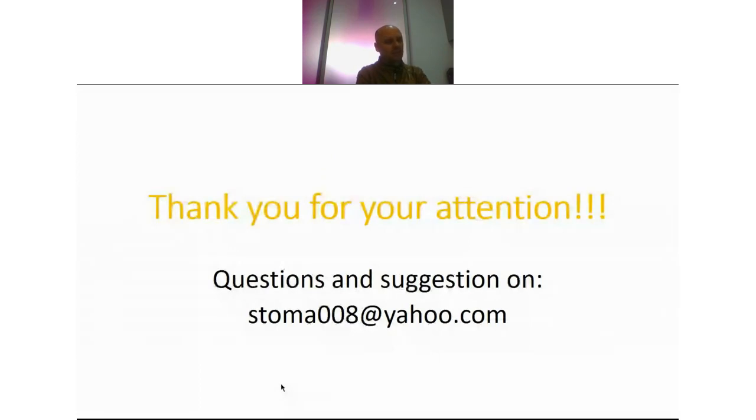But when you have the opportunity to exercise live on our workshops with this kind of data, then in a matter of minutes everything is clear, and you are able to know how to do it, what to check, and how to proceed for other issues which are important for implant guided surgery.